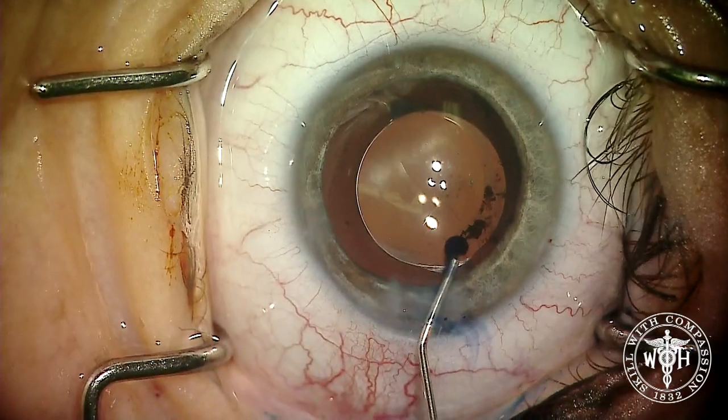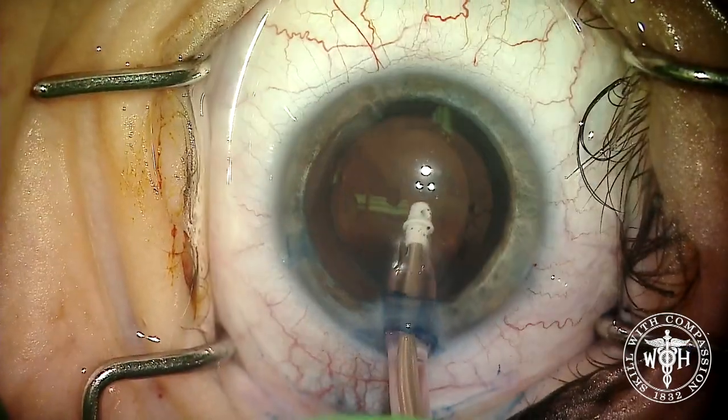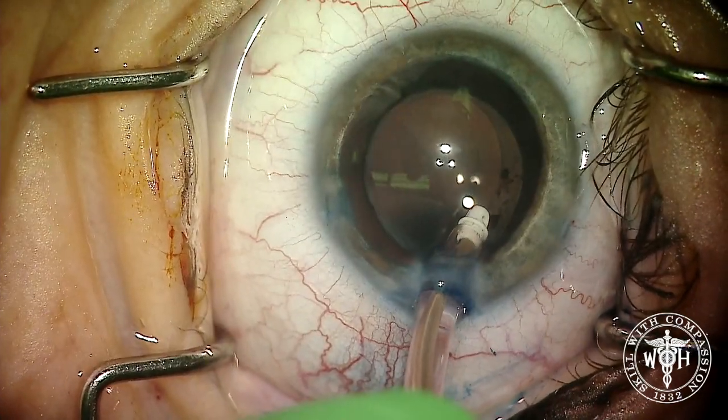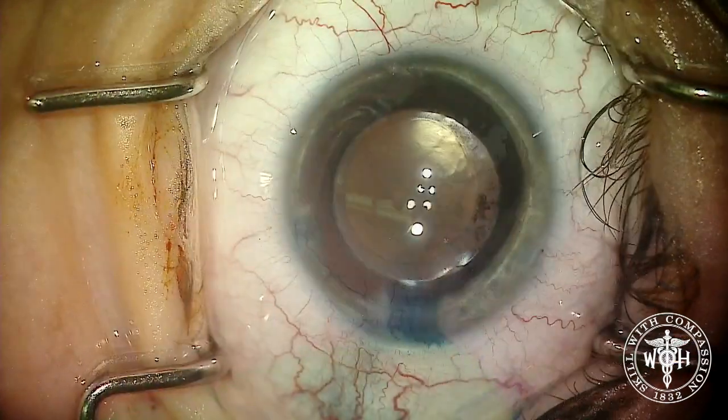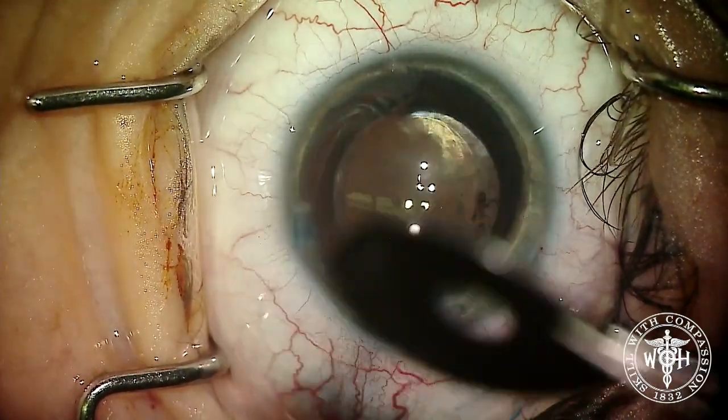After removing all the viscoelastic from the capsular bag, we counterstain with additional Vision Blue. This second staining of the capsule allows us to see the capsulorhexis edge clearly once we start placing the artificial iris, to confirm that the synthetic iris is going into the capsular bag.